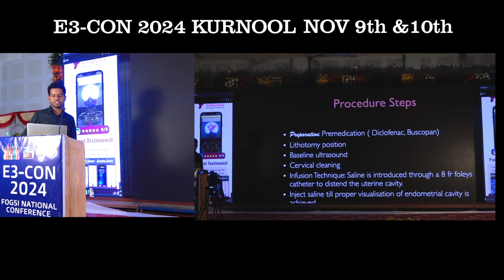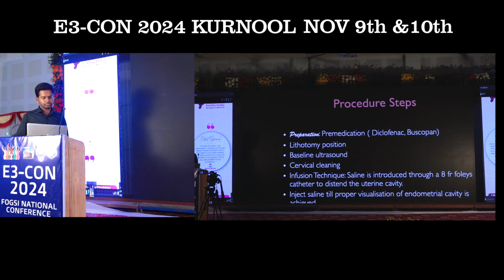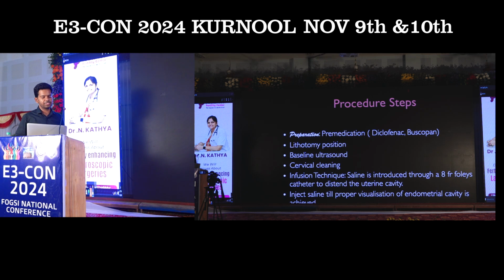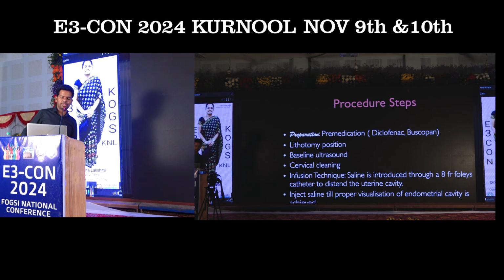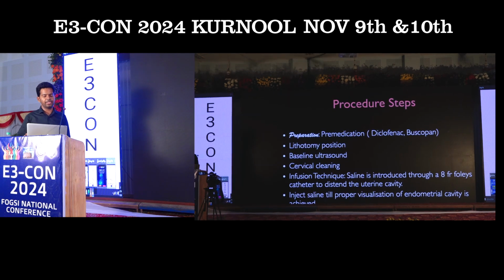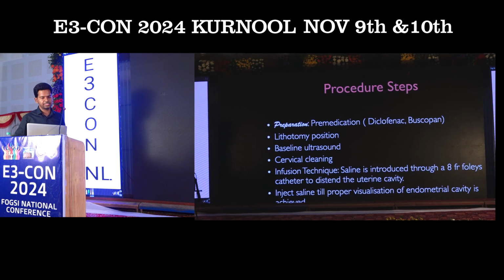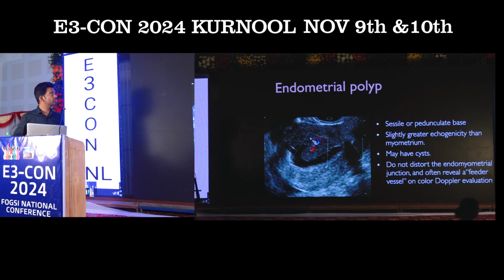The procedural steps are: we give premedication with diclofenac and buscopan to relieve anxiety and pain, and the patient is kept in lithotomy position with baseline TVS findings noted. Cervical cleaning is done with betadine, an 8 French Foley's catheter is introduced, saline is instilled into the endometrial cavity, and TVS is then performed.